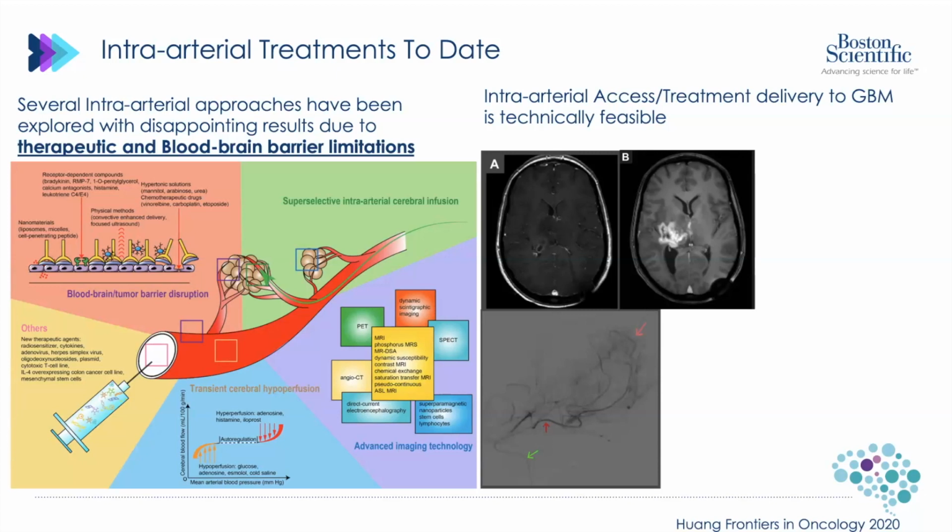So you're giving drug here, in this case yttrium 90, in the distribution of just that tumor. So the rest of the brain, you can see on the angiogram, is spared whatever treatment you're getting. So that's why intraarterial drug delivery is better than intravenous.